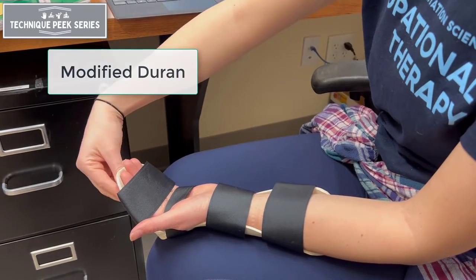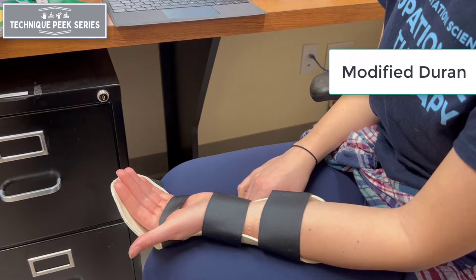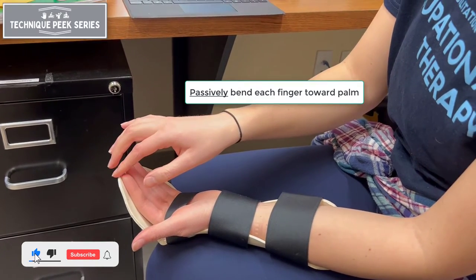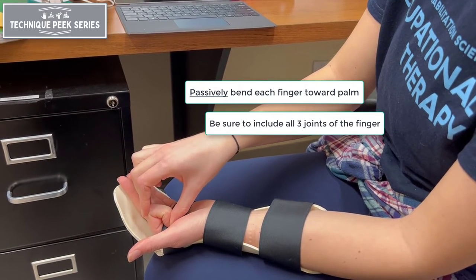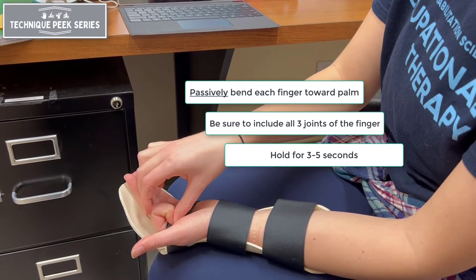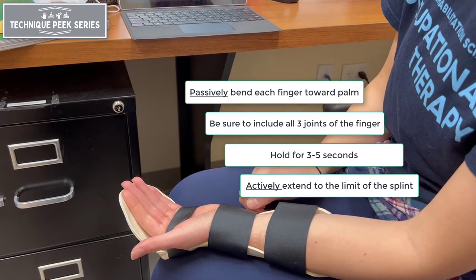For Modified Duran, have the patient undo the top strap of their splint. Next, have the patient passively flex each finger towards the palm until they feel a mild to moderate stretch. Be sure to include all three finger joints, holding for three to five seconds and actively extending the finger to the limit of the splint.